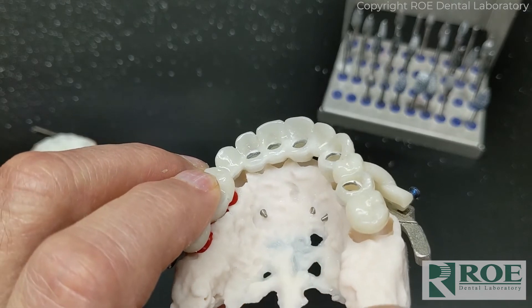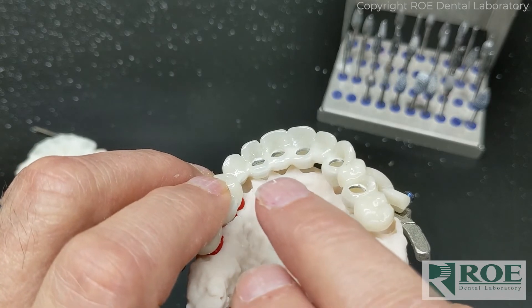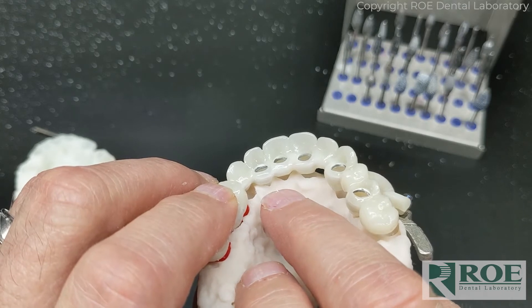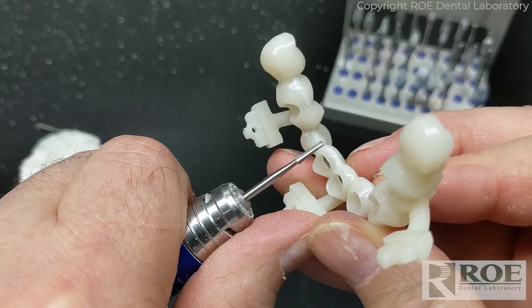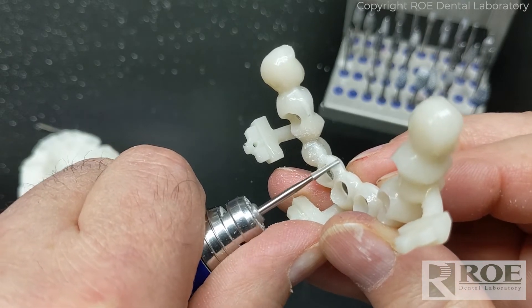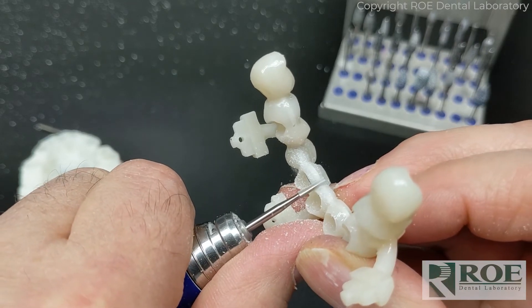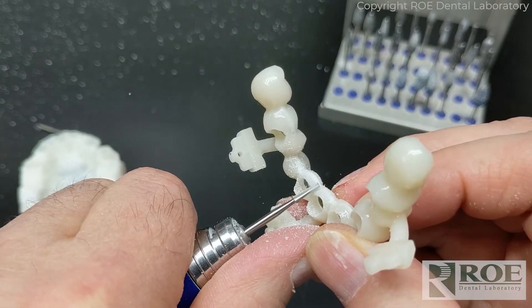The patient's right side is now seated and we're moving anteriorly. In the number seven and eight area I can see the teeth on the prosthetic are touching bone, so I'm going to relieve the prosthetic where I can and then relieve the bone the rest of the way. There are areas on the prosthetic where it's a little heavy — I'm going to taper a little around the neck of the teeth on the lingual side to save as much bone as we can while getting the rest of it seated.